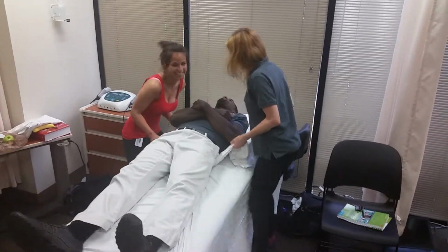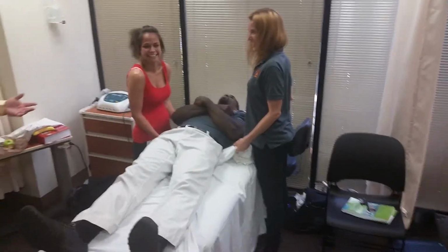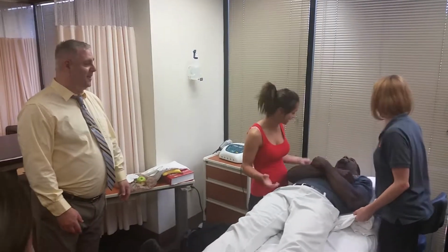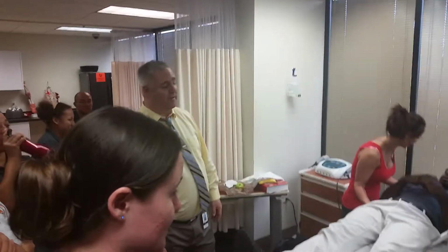Nice. He's going to fall. So that's what you're going to be doing a lot of in your day. You say, no, I don't like this, this is not going to happen. If you're in a hospital without a lift team, most hospitals don't have it. Nursing homes don't have it.